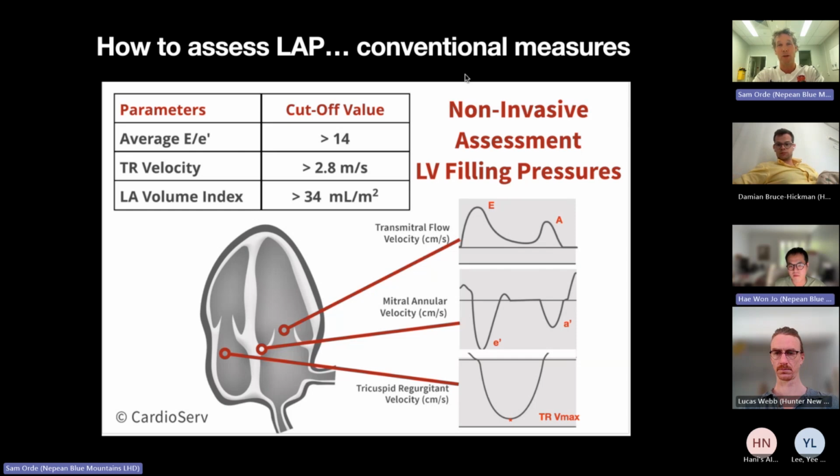That's what, and correct me if I'm wrong, because I'm still on this journey trying to figure this out. I must have given lectures on this for 10 years and I still don't think I've got it quite right yet. But at the end of the day, hopefully with this lecture, you'll see I'm trying to keep it pretty simple. It's all about left atrial pressure, right? It's all about trying to figure out what that pressure is. If it's getting too high, you're going to mess up the lungs. And if you get it too low, it doesn't fill the left ventricle.